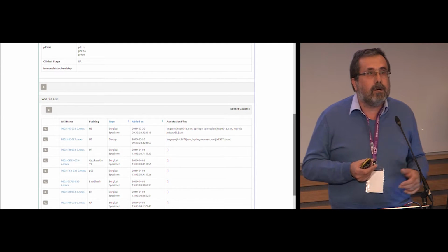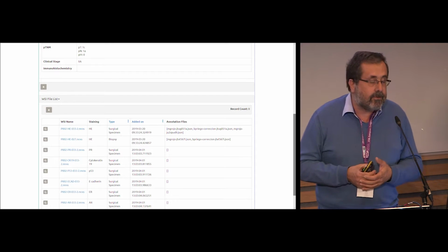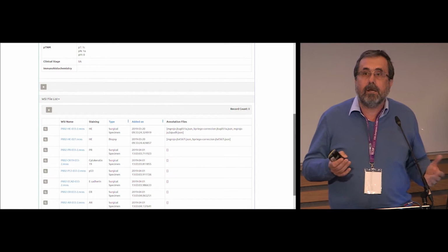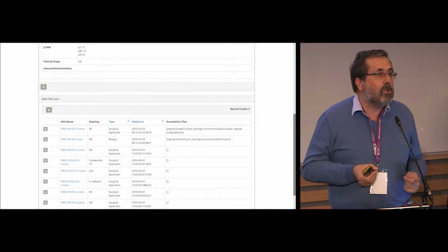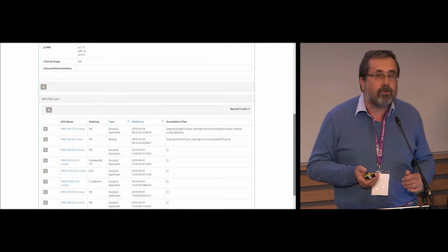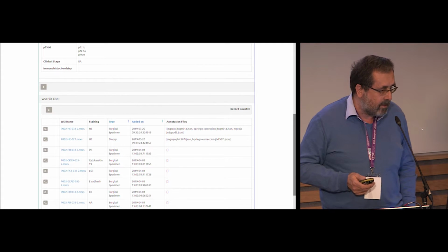In fact, there are some vendors that are able to do this registration, this linking between H&E and immunohistochemistry automatically, and then they can avoid doing this manual segmentation, because they can automate these segmentations thanks to the information from the immunohistochemistry. I think this is a very good approach. We are not doing that, but I think we should also work on that.